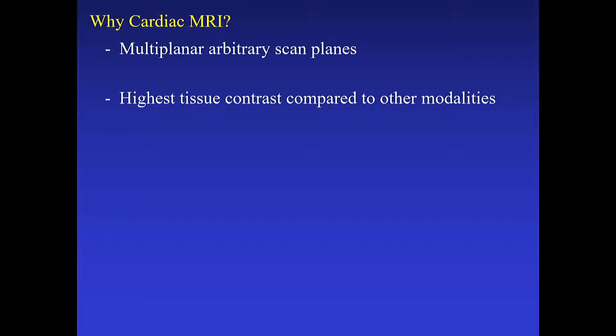A key strength of cardiac MRI is the fact that with or without contrast usage, cardiac MRI can discern the different types of tissues in the heart and surrounding structures, and be able to tell normal or pathologic states. You can also tell, for example, fat versus myocardium, and within the myocardium whether it is accumulating contrast or not. There are also non-contrast techniques that are already proven to be useful in determining pathologic conditions of the heart, and you will see examples of these.